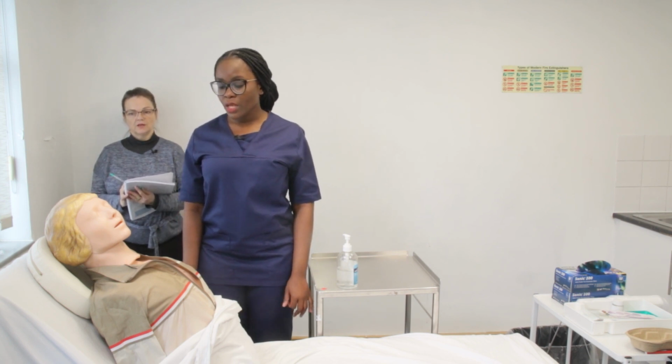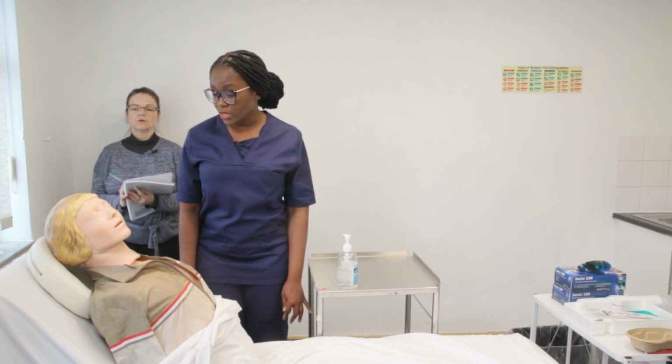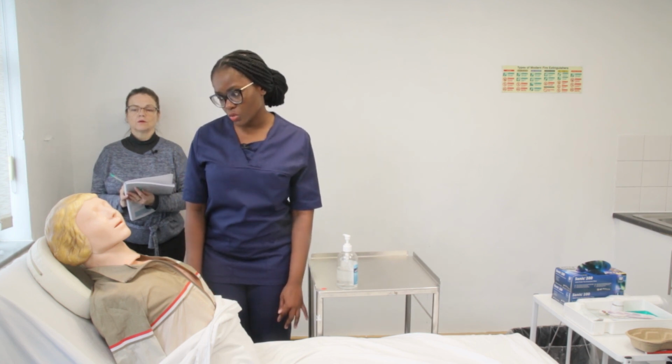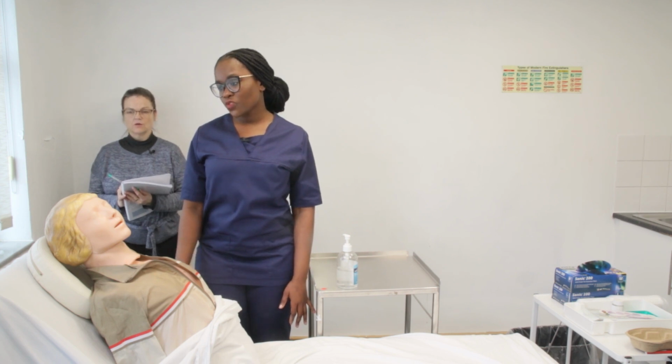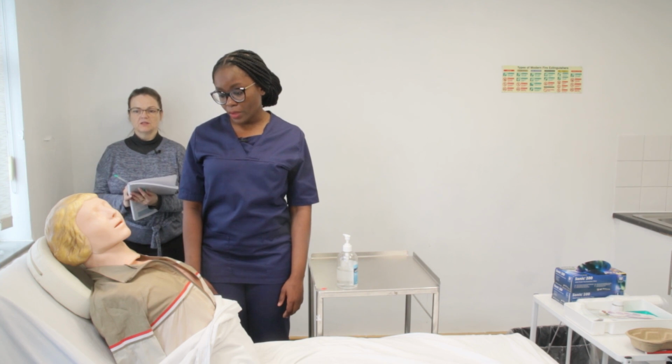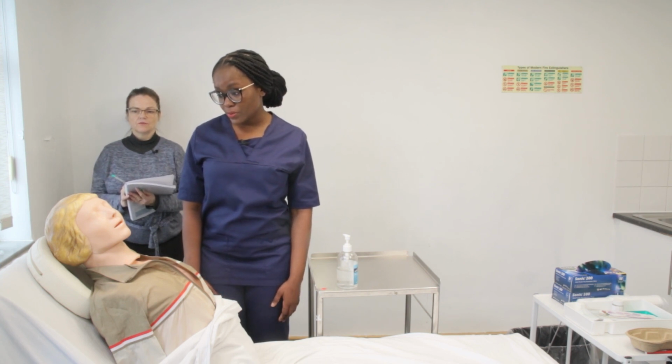Okay Sue, so we are actually going to insert your NG today. I believe the doctor has discussed this with you. Yes. This is for us to feed you and also pass your medication. Is that okay? Right. Okay, and are you comfortable and happy for me to proceed?